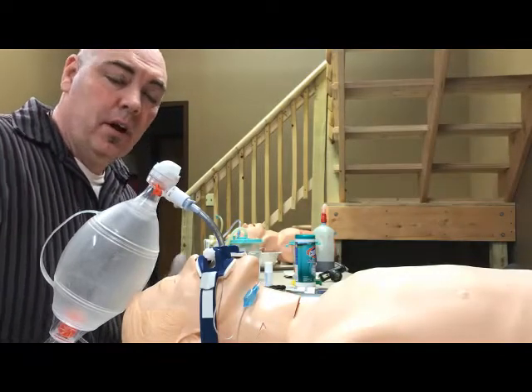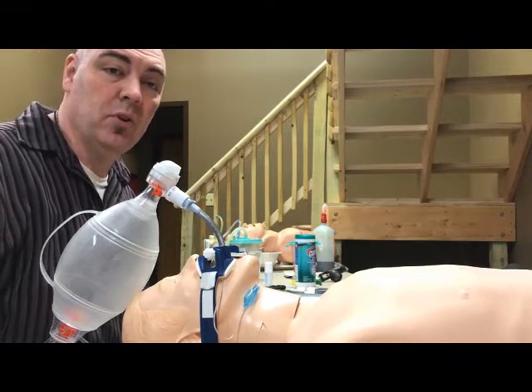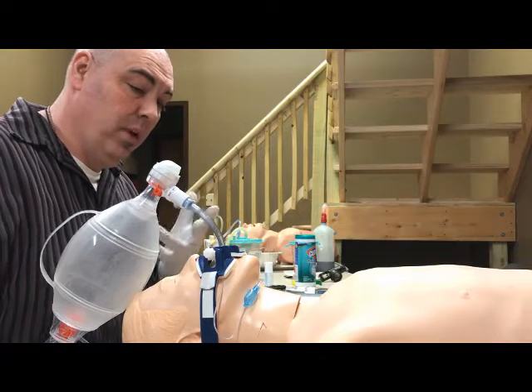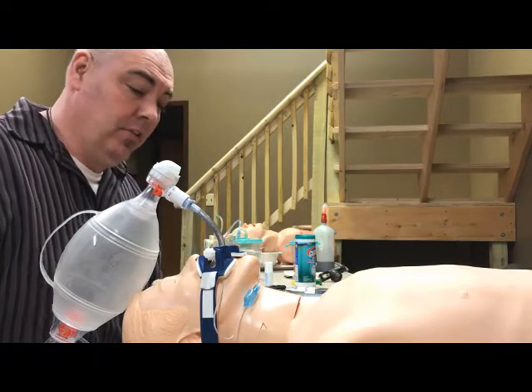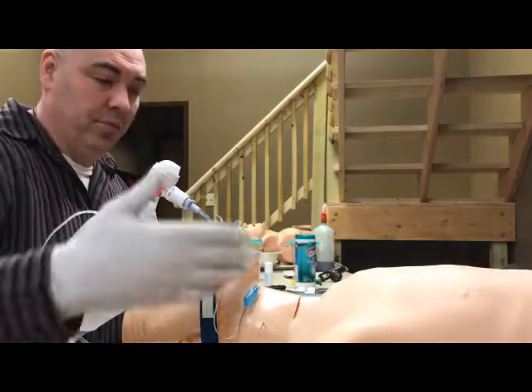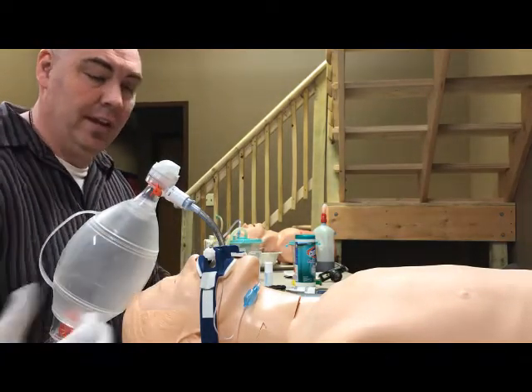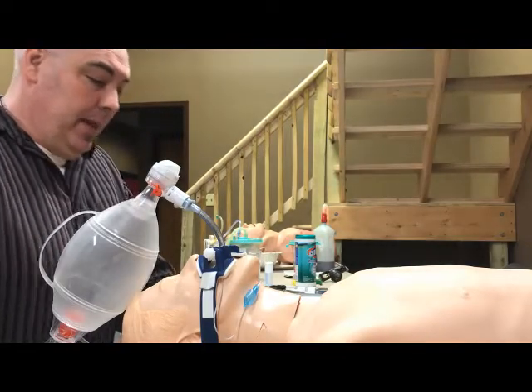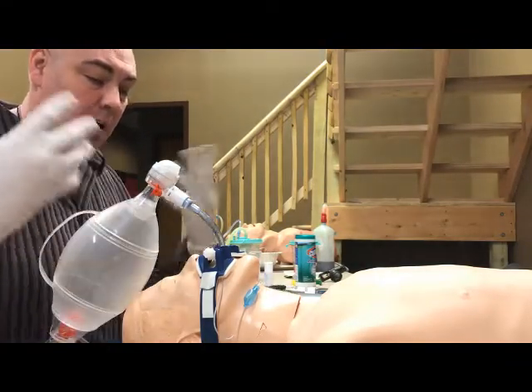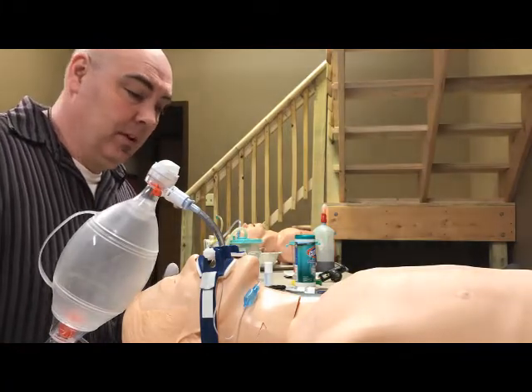A quick overview of using the Hudson multi-adapter to put albuterol treatments in line with someone who's been intubated. This can also be used with a bag valve mask. For the sake of this scenario, we've had an asthmatic patient who needed to be intubated. The ET tube is in and the patient is still wheezing, so we want to add albuterol to our treatment as per protocol.